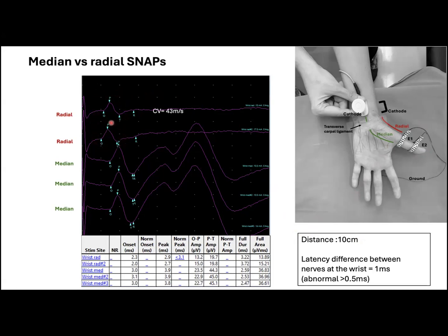The bottom tracings here represent median snaps, where the intensities were also gradually increased. With supermaximal stimulation, we can see that a motor response follows the sensory response. As we have good amplitudes, there is a clear separation between the sensory response and the motor artifact, but the recognition of a sensory response could be a problem if the snaps were small or had prolonged latencies.